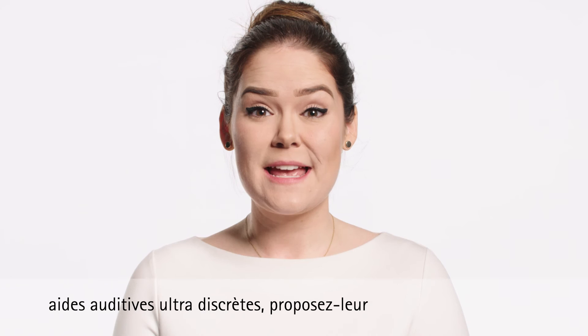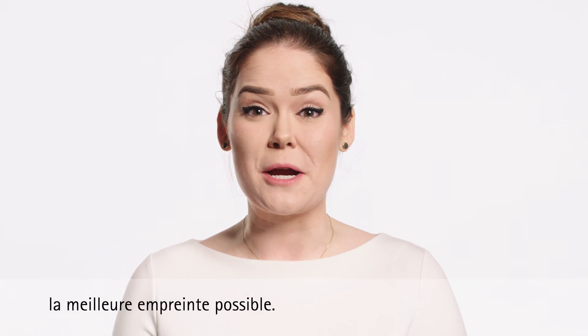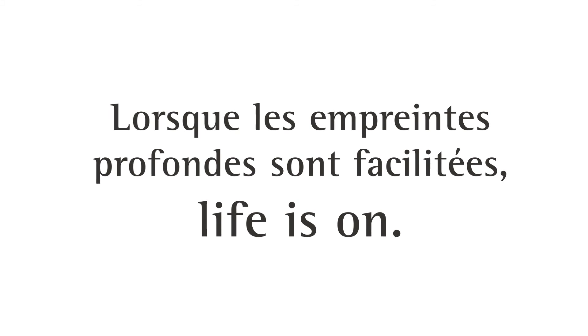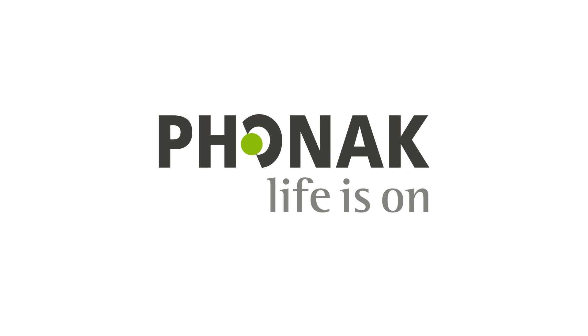When your patients are asking for super discreet hearing aids, make sure to get them the best possible device by taking the best possible impression. Easy View Oda Block — when deep ear impressions are made easy. Life is on. Phonak — Life is on.